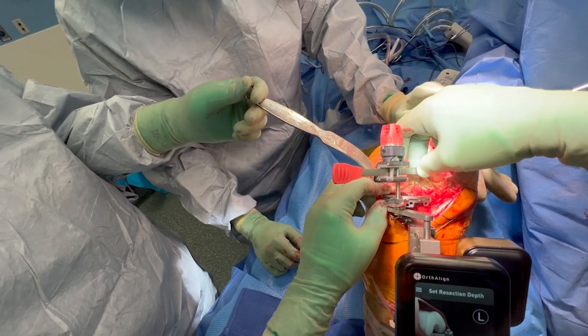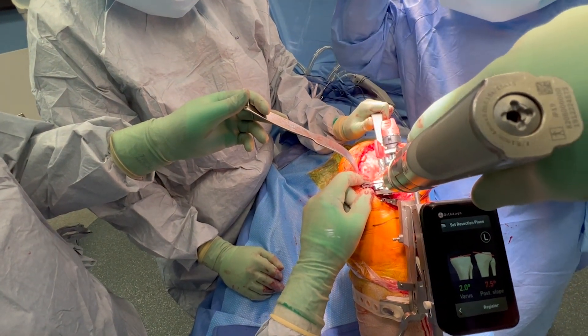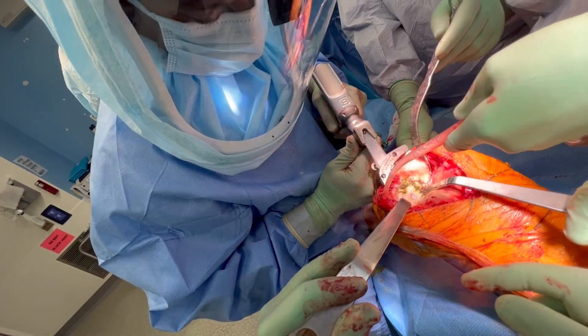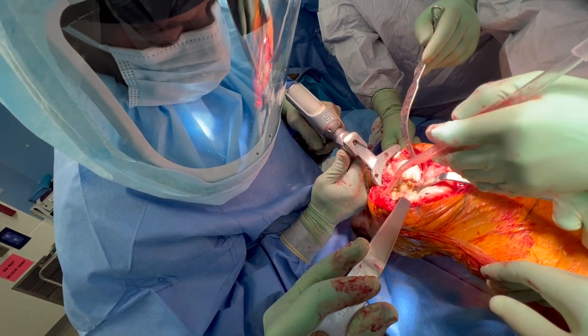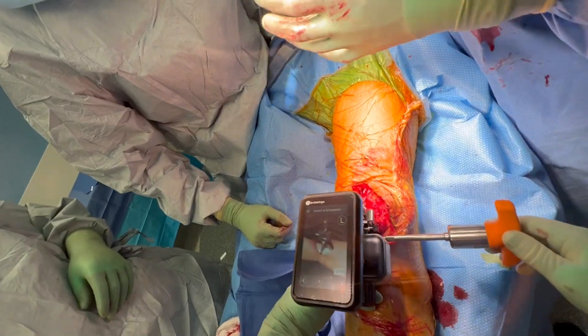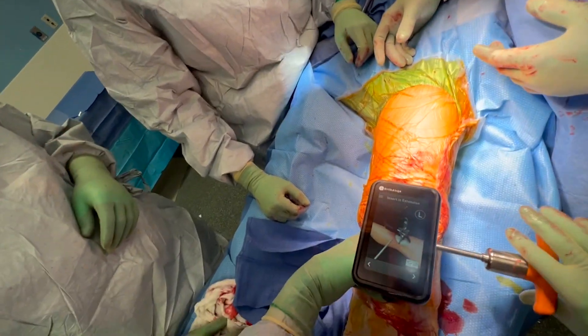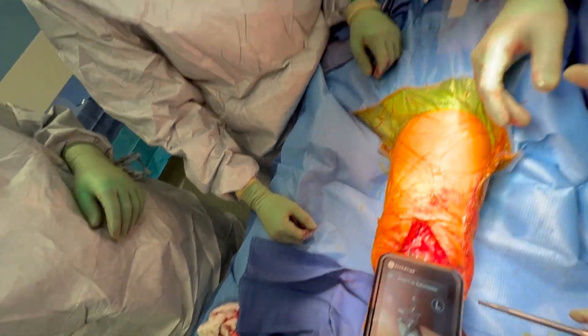We go ahead and set the depth of resection. Usually I'm going to take about nine or ten millimeters off of the uninvolved side on the proximal tibia. Once I'm totally sure my cutting block is appropriately aligned, we make our proximal tibial cut and remove that cut piece of bone. Then we check the extension gap. Lantern Balance — pretty simple, you just drop it in, make sure those paddles are even on both the medial and lateral condyle.